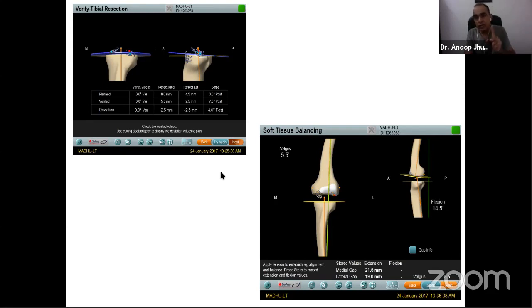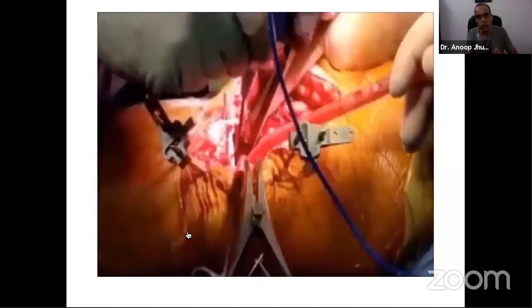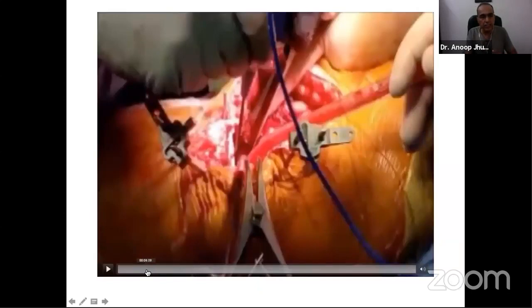Now, this is the graph on the right bottom, before any soft tissue release. Now, here you can see 5-degree valgus still and a 14-degree flexion still. So we still need correction, but we don't need more bony cut. The reason is when we correct the coronal plane deformity, that is the valgus, the FFD also corrects. So correction of the coronal plane deformity corrects the sagittal plane deformity also. That's an important message. Now let's look at the soft tissue balancing of this particular knee through this video.